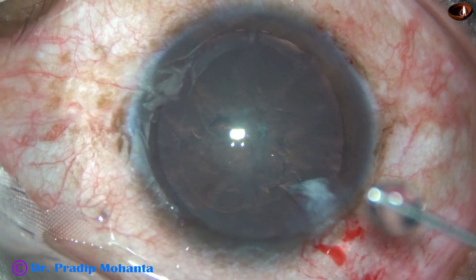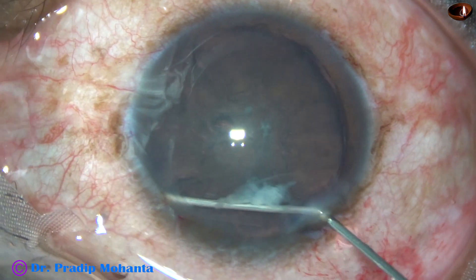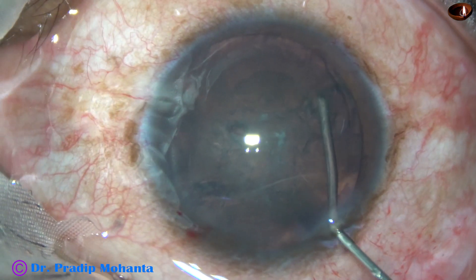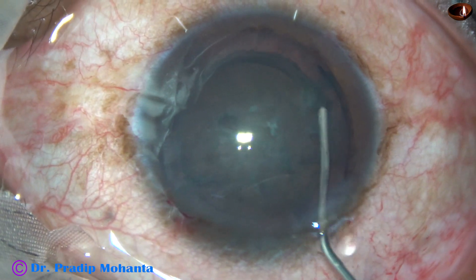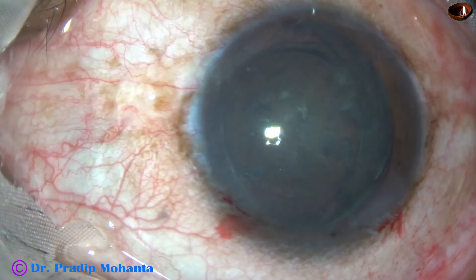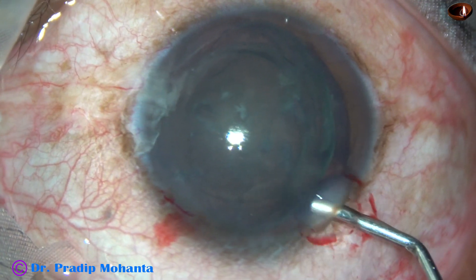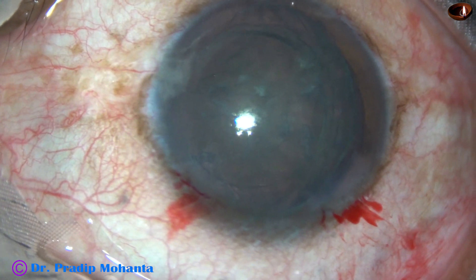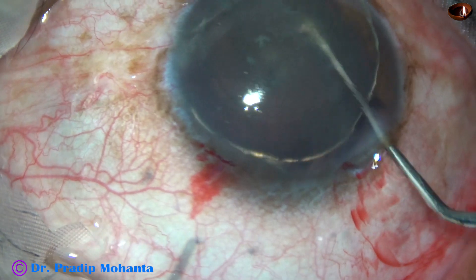Now hydro-dissection is done. My plan is to prolapse one part of the equator — or half of the equator — and then manage the nucleus. I did some hydro-delineation also. Again as I try to do hydro-dissection, the nucleus equator on the right side came out of the bag. And now in this very soft cataract I plan to remove the nucleus completely out of the bag, so I rotate the nucleus and it is out of the bag.